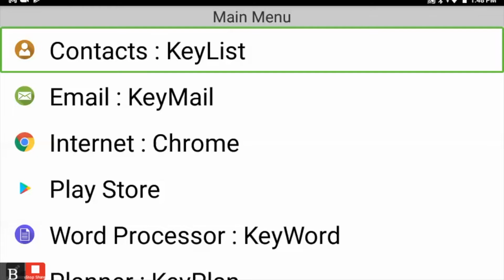And so we're talking about the thumb keys. There are technically 4 thumb keys, and these are kind of rectangular buttons. There are 2 that are shorter rectangles and 2 that are longer rectangles. The 2 shorter rectangles are on the far left and far right. The left one is called previous, the right one is called next. So as you can imagine, if you press the right one, that's going to take you to the next item in the list, which for us is going to be email.